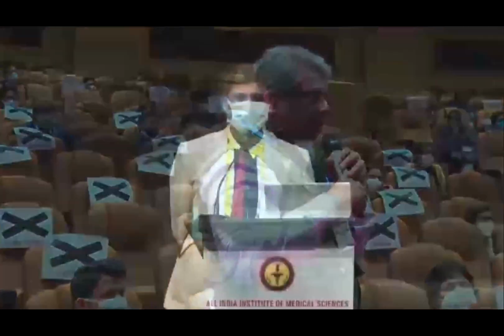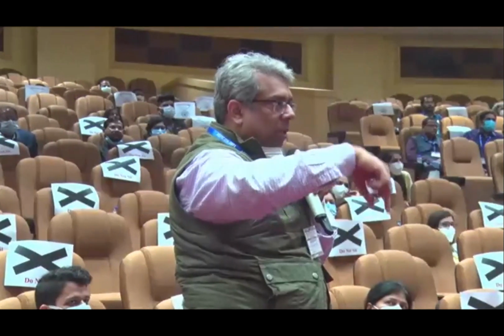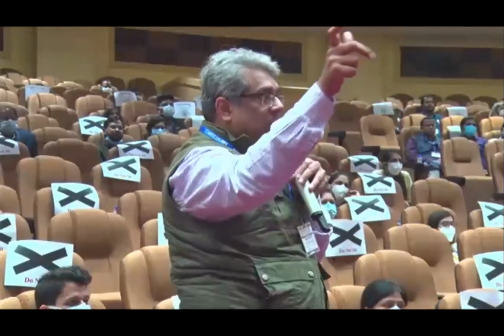Thank you. Yes, Sumit. Give the mic. So another diagnostic steward, Dr. Sumit, will have a session tomorrow. Both of us are actually processing pediatric colonies, right? Colonies grown for 6 to 8 hours from neonatal samples. I call them pediatric colonies. I am from a pediatric institute. In your personal experience, have you found any difference between the susceptibility profile of a colony at 6 to 8 hours versus a colony at 16 to 18 hours? Because when I was following this practice, some of the senior people used to say that you're being over-enthusiastic in reporting. There's going to be a difference in both of them. What you're processing at 6 to 8 hours, colonies, you're telling? Yes, from the colonies.